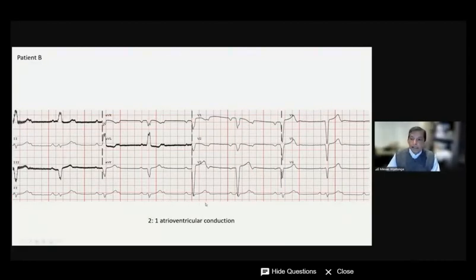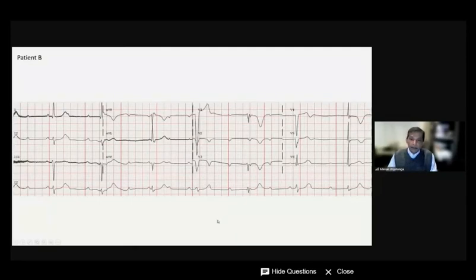And this is another patient with 2-to-1 block. This is an elderly lady. You have sinus rhythm, and this is a left bundle branch block pattern. Remember I told you, in V1, if the predominant QRS is downgoing and wide, we call it left bundle; if it's going up and wide, we call it right bundle. So sinus rhythm and left bundle, and this beat gets blocked, 2-to-1 block. I waited a little longer, and what do I see? The patient has complete heart block here. We see the P waves are firing separately from the QRS. Fortunately this patient has an escape rhythm, but this is a complete heart block. So the block must be below the AV node. Just by waiting, this patient obviously needed a pacemaker, whereas my previous patient probably doesn't need one immediately unless there are symptoms.